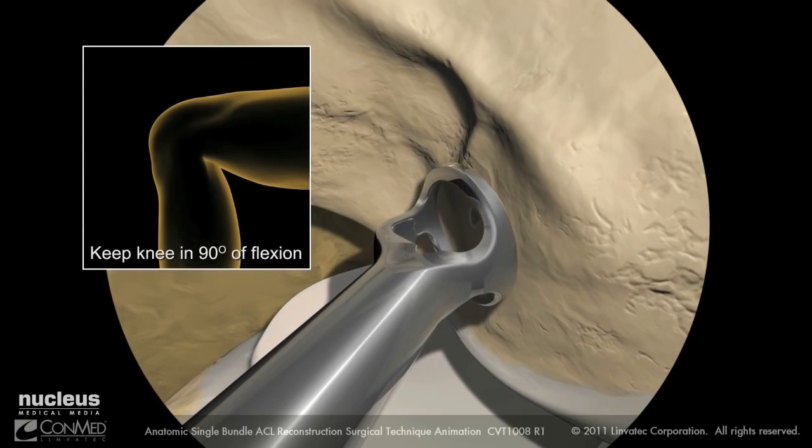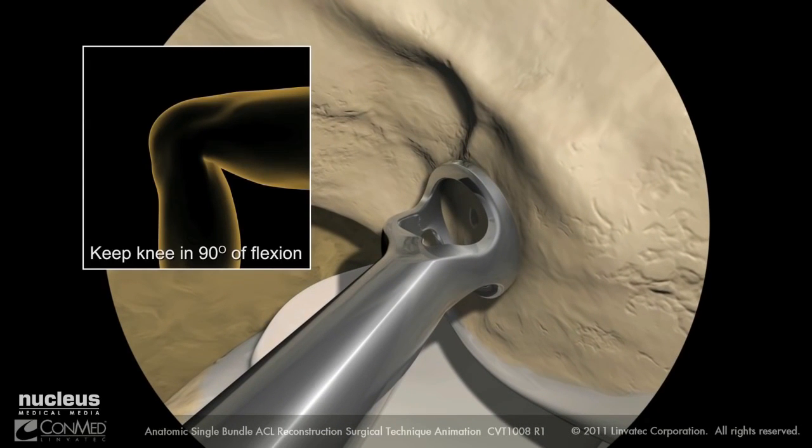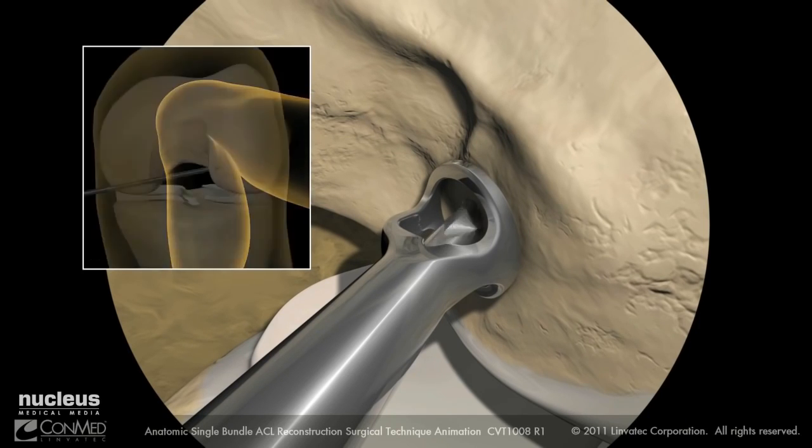Once the correct position is achieved, advance the guide pin into the femur a few millimeters to notch the bone. Back the guide pin out to check that it correlates to the mark you made earlier in the center of the footprint. Using the guide to position the guide pin, hyperflex and elevate the knee.